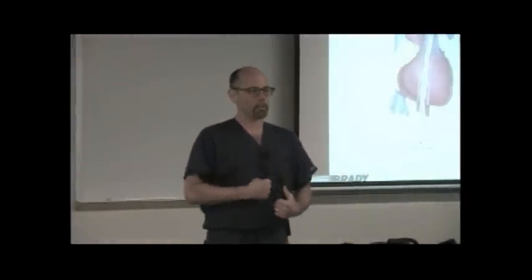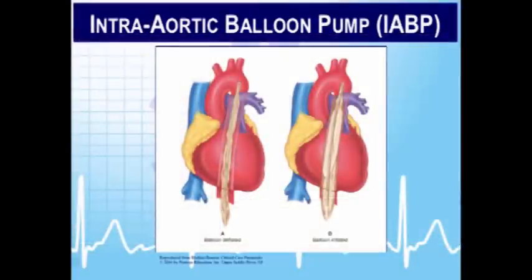Why is that being told to you? Because when you move a patient around with a balloon pump in them, that's when the balloon pump shifts. It can move inside the body. We want to be able to move it because we don't want it to get stuck in a certain spot. We want to be able to adjust it if need be. So it is a mobile catheter. You cannot sit a patient up, bolt upright, much above 30 degrees. Otherwise, that will cause the catheter to advance and the balloon will obstruct the subclavian artery. So that's where it's positioned.